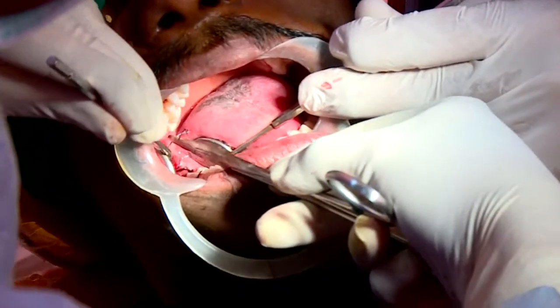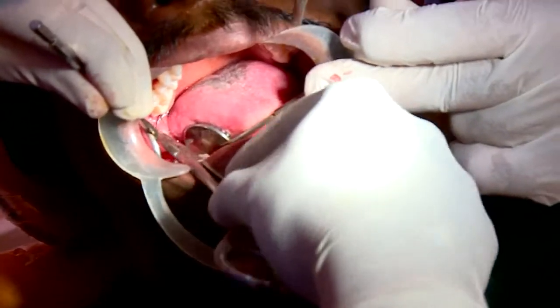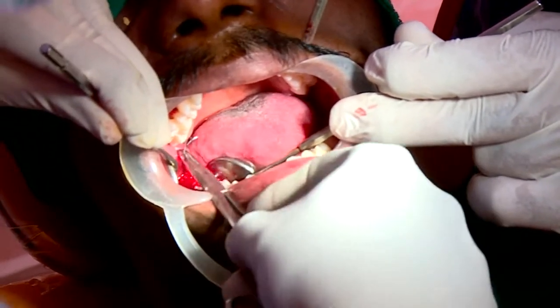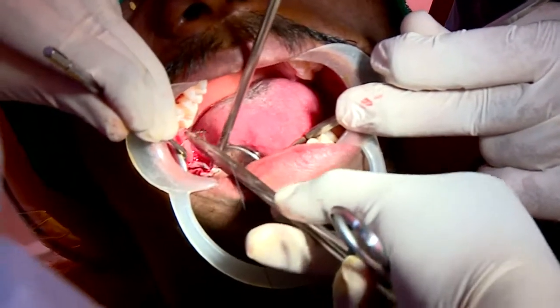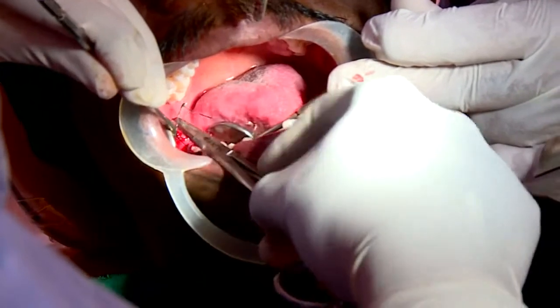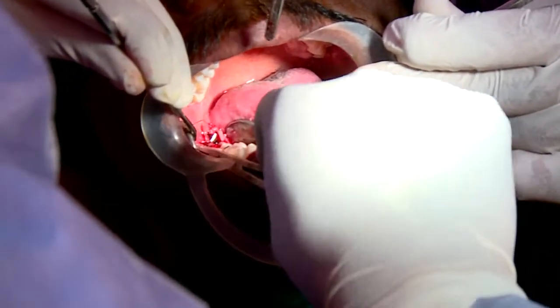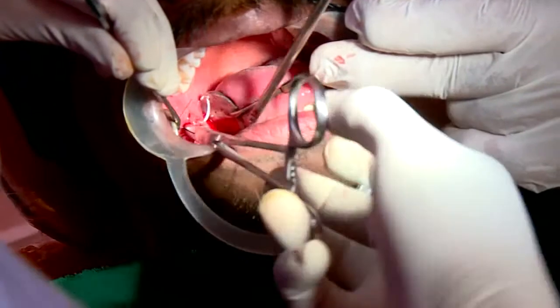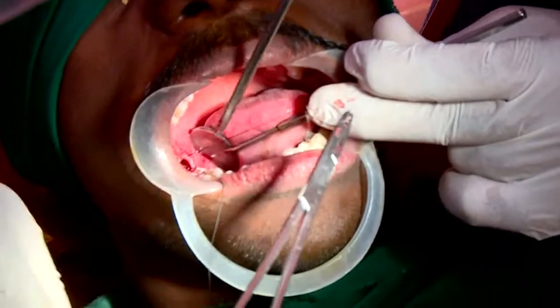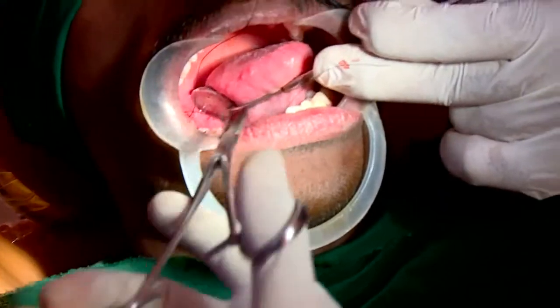When we remove the tooth in front, 7 was still obstructing the path of exit. So we remove the top part of the crown, that is, we split the crown into a couple of further pieces and remove the crown. After that there is an empty space. So we push the remaining two into the space, access it and remove it.